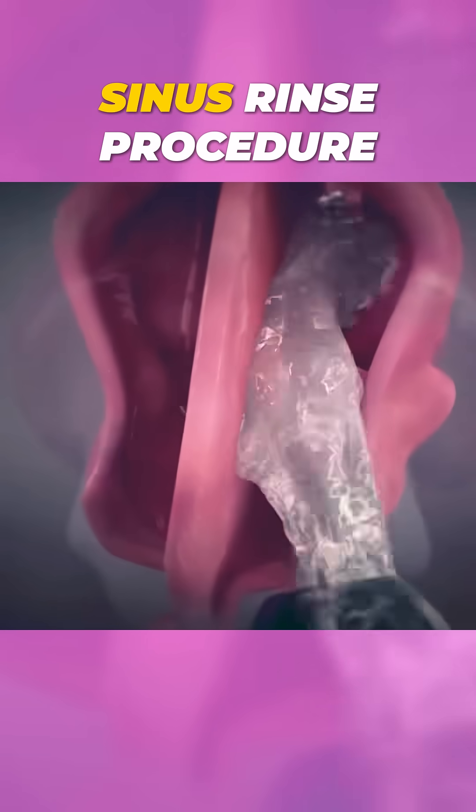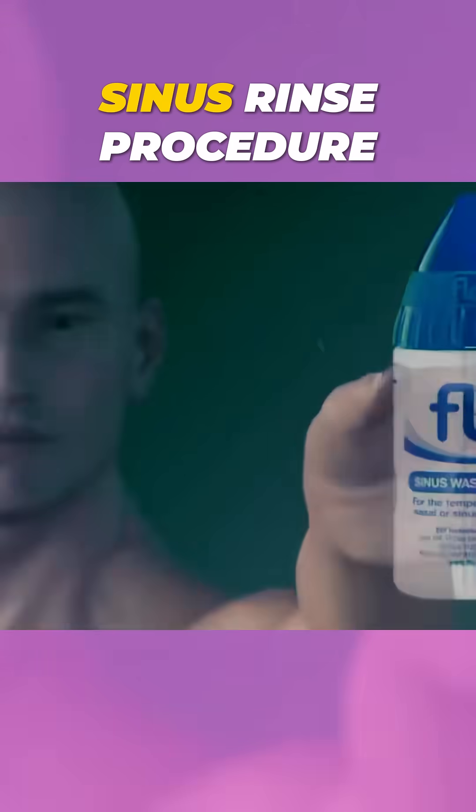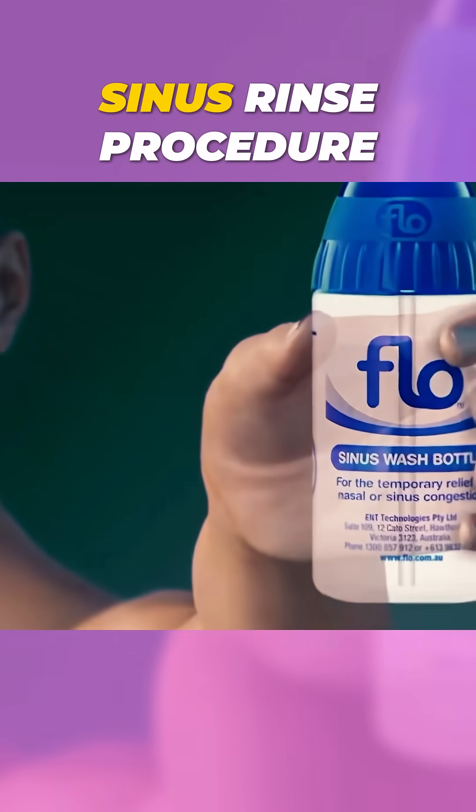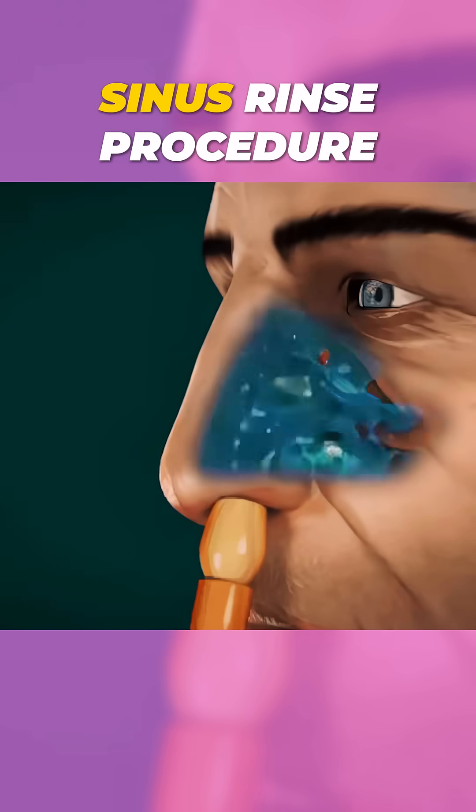Ever wondered how a sinus rinse procedure is performed? Let's dive in. First, you fill a special bottle or neti pot with a saline solution. This helps to clear out mucus and allergens.